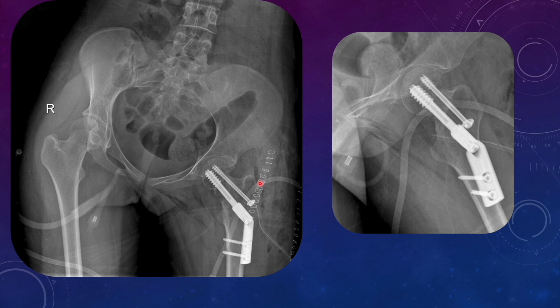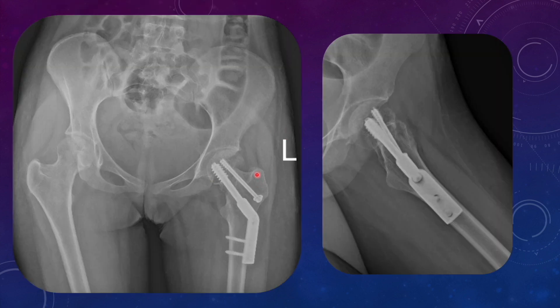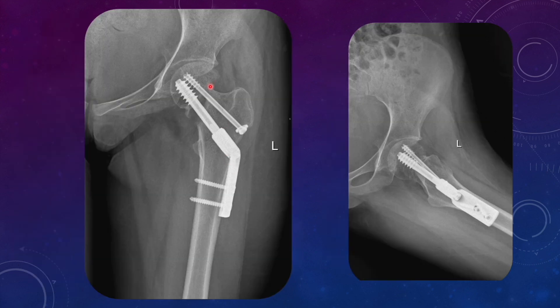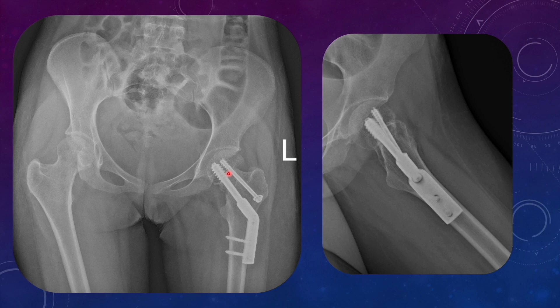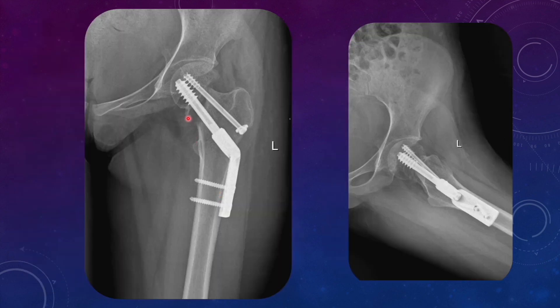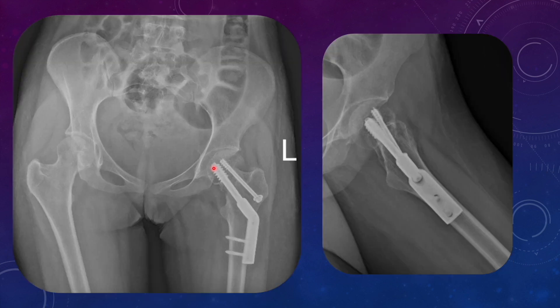At the 3-month follow-up radiograph, the pelvic tilt is improving, and importantly there is no loss of reduction and no collapse. The fracture site visible in the previous radiograph has started disappearing, and the empty area where a remnant of the femoral neck was present is getting filled with new bone — the remnant is progressing towards the calcar. In the lateral view, alignment remains good.